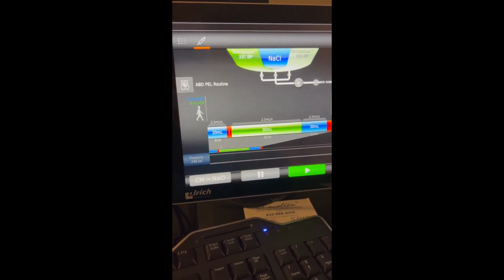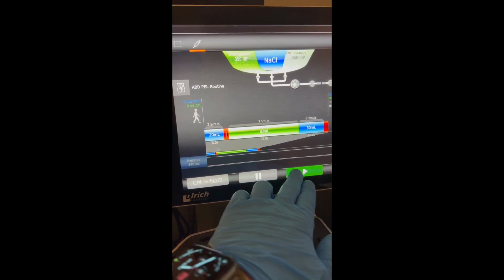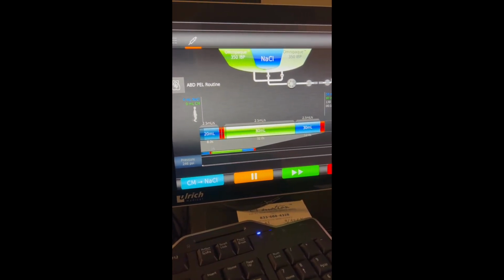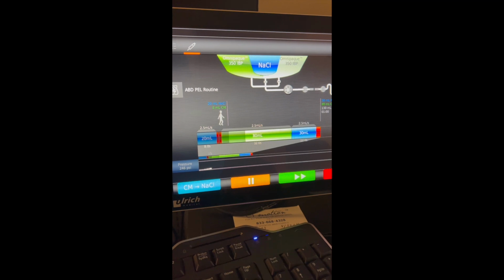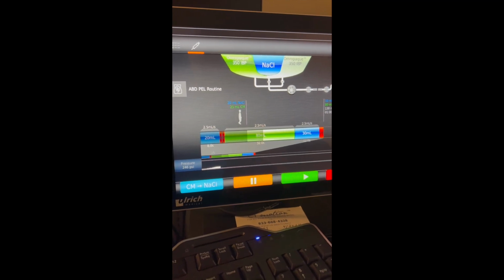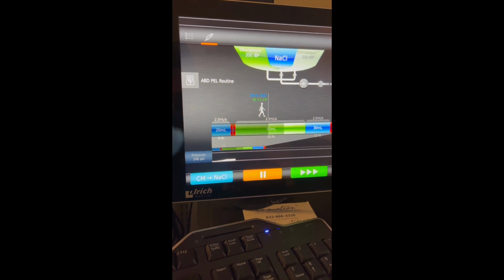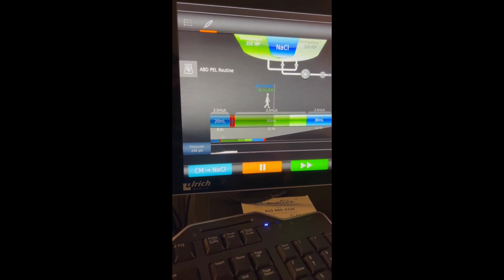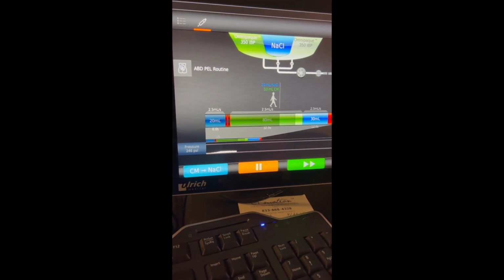So once you get the patient set up, we're going to go ahead and do the test injection. And once you click this, then you're going to see it's going to start flowing. We want to make sure to watch that. And then once you click that other button, you're going to see the contrast flowing. Down here you got your pressure limit, so it'll tell you if it's going up too fast or not. Now we have 2 lines here. The second one's where the contrast actually is.